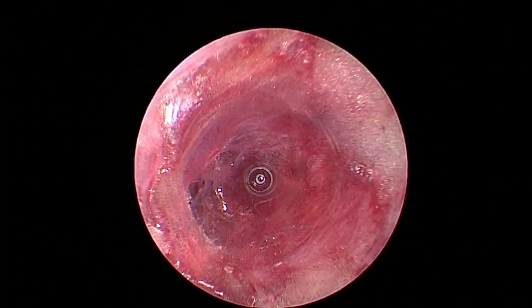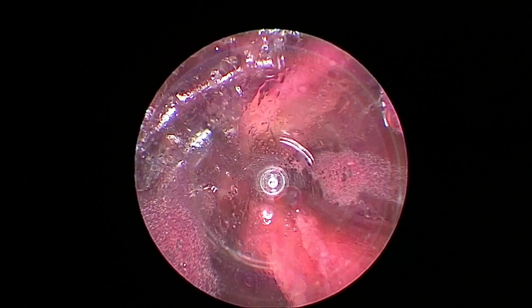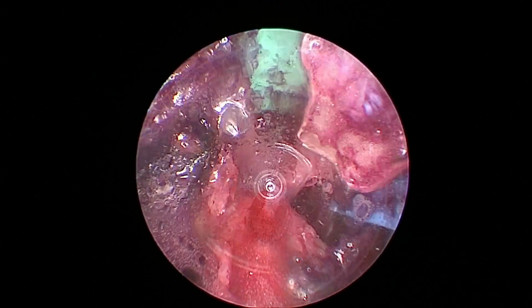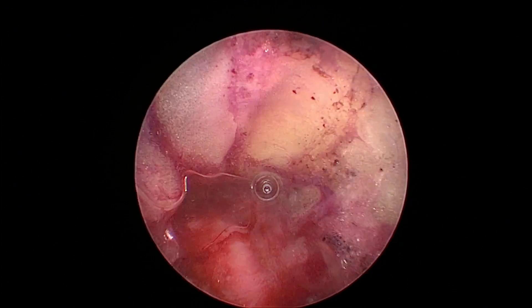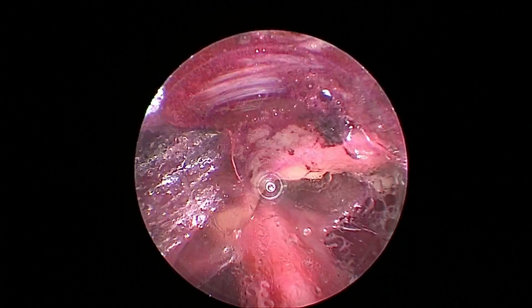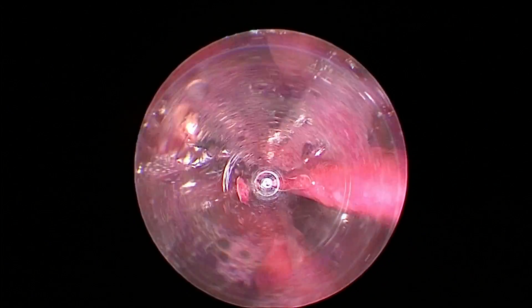I'm going to work right side, left side, back and forth. Here's another small branch — I'm just going to make a tiny window. I don't know if I have enough room to take that, so I'm just going to cauterize it and not try to cut that yet. You can see the vein. I decided to back off and create a little more space before I took that branch, so I'm working lateral to the paired veins. And now I'm going to take a little fascia — I'm going to go above the fascia and create some space.